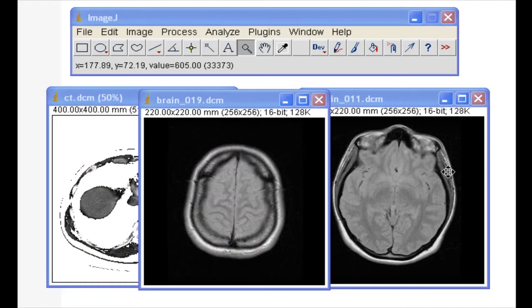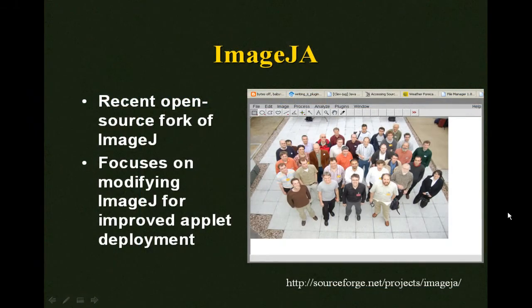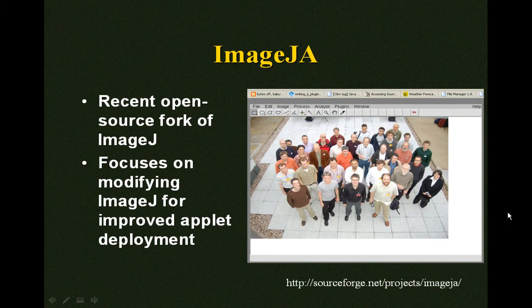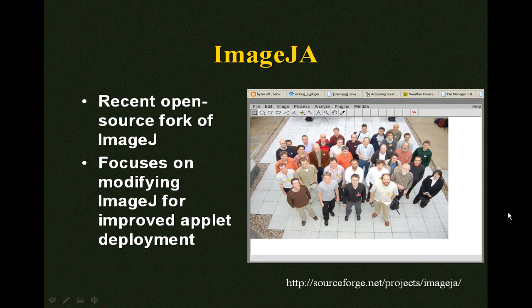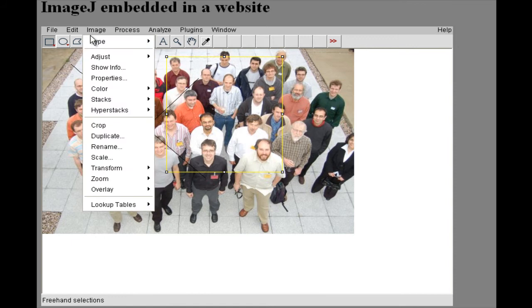ImageJ has a plug-in architecture and there are quite a few plug-ins available online, making it easy to extend the functionality of the editor. One problem with ImageJ is that the look and feel of the editor makes it inappropriate for deployment as an embedded applet. Recently, an open source project called ImageJ-A was created to improve applet deployments in ImageJ. ImageJ-A is a fork of ImageJ with some minor modifications, and you can see that the look and feel make it more appropriate, with images shown in a single embedded scroll panel instead of in multiple floating windows.